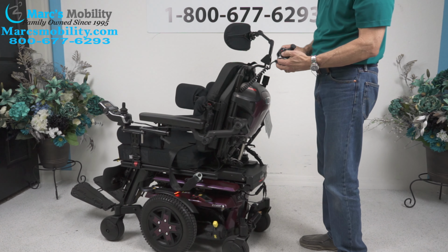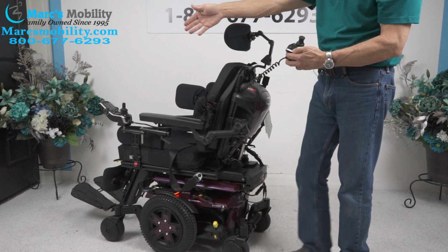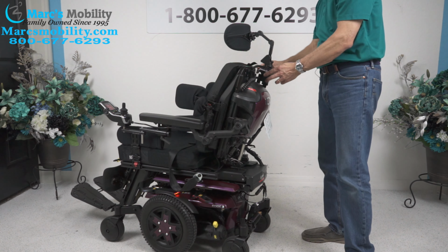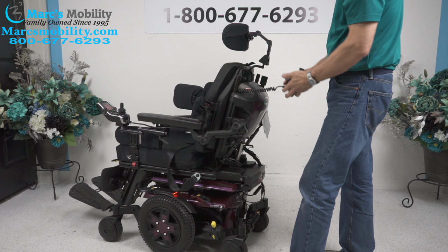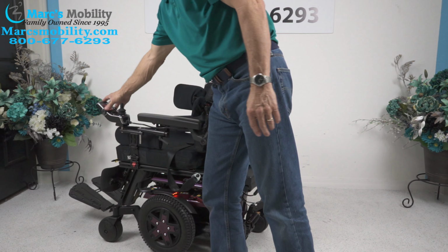I'm going to turn it off. When I turn it off over here, it turns that one off, so I have to turn this one back on. And when this one turns back on, then the power is back to the front. So you can leave it hooked up there and drive it like this, or on the headrest, or here, or you can just have it in your hand. Okay. So we're back to the front now.